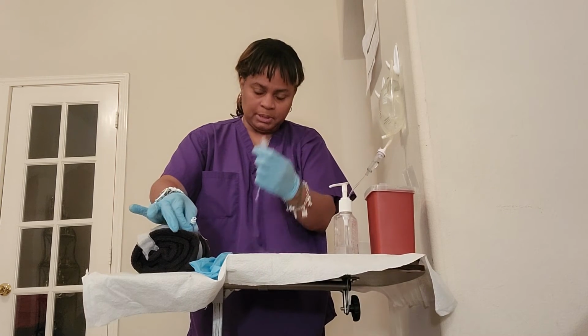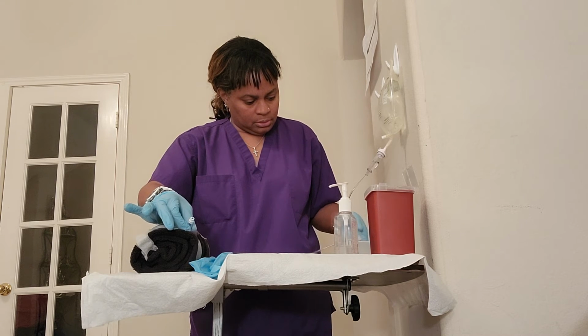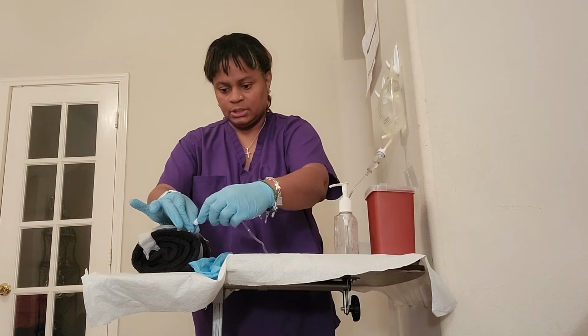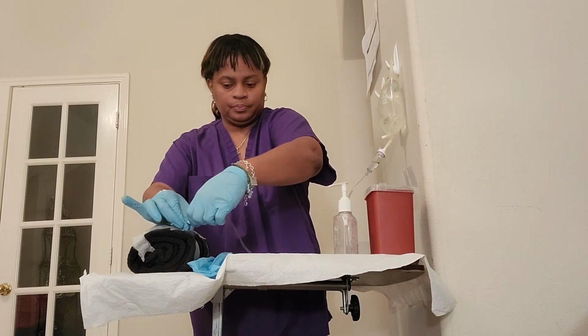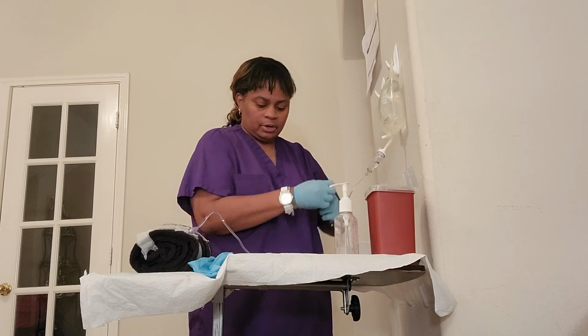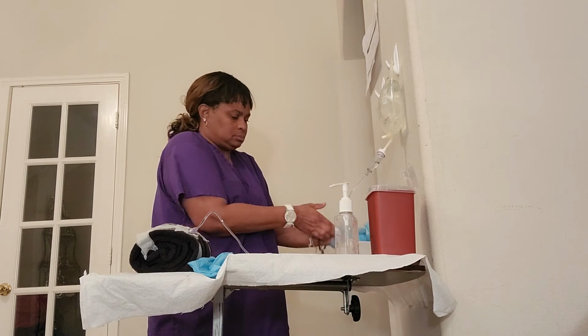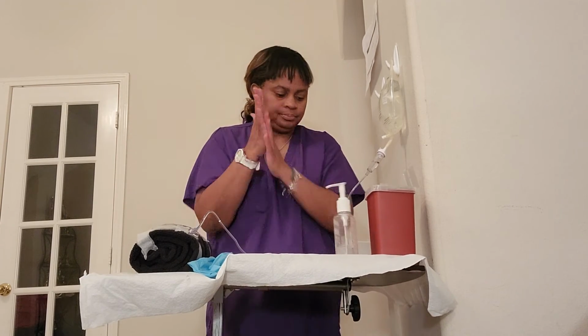Then I'm going to get my IV tubing, and I'm going to connect it to the hub. I'm going to discard my gloves, perform hand hygiene.